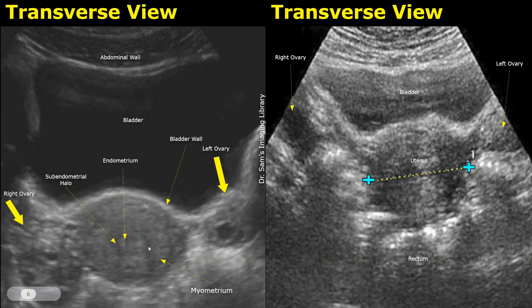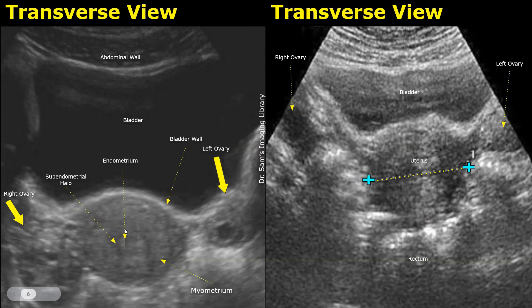These are transverse images showing the bladder, the uterus, and the ovaries. This is the abdominal wall, followed by the distended bladder. You can see the uterus in the middle and the ovaries on its sides. This is the myometrium. The subendometrial halo can also be seen here, appearing as a subtle hypoechoic circle around the endometrium. Within the ovaries, you can see the follicles — one in the left ovary and around five follicles in the right ovary.